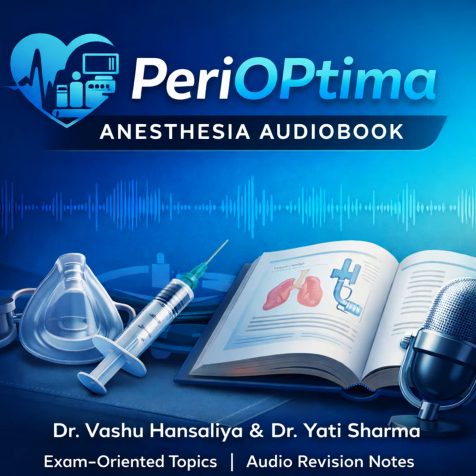Number 1, without a doubt, is the fulcrum error. Do not say you lever against the teeth. Emphasize that the lifting vector is 45 degrees up and away. Secondly, the VL trap. For hyperangulated VLs, you must state that you need to use a pre-shaped hockey stick stylet. Forgetting that is a major clinical and exam failure.